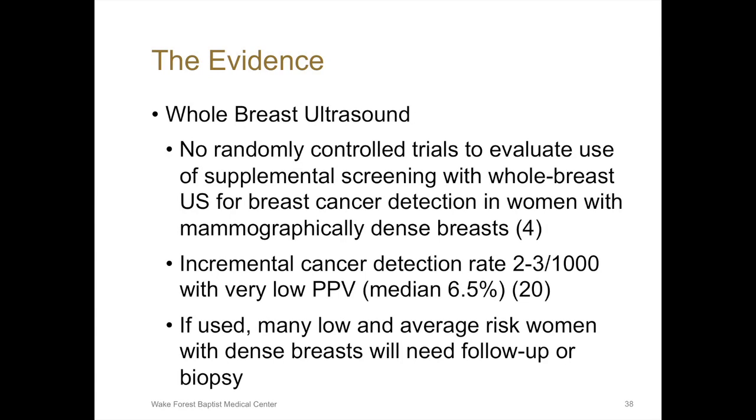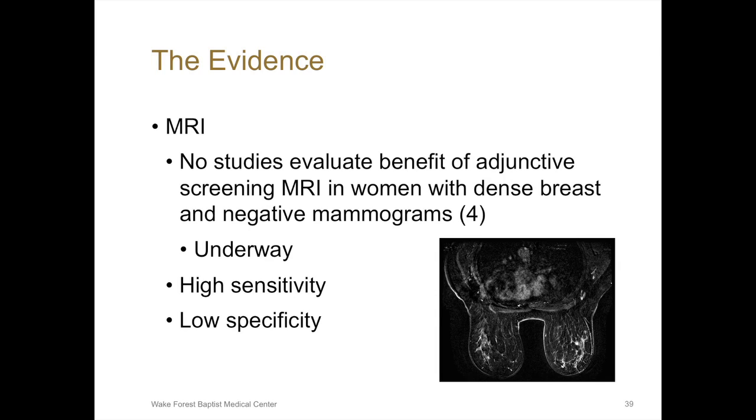So if you used whole breast ultrasound, and again, it's important to stress this is for low and average risk women, you're going to have a lot of women coming back for follow-up or biopsy with benign results. What about MRI?